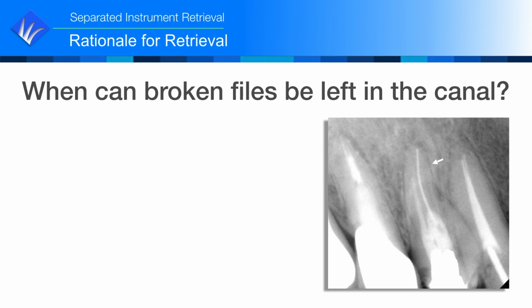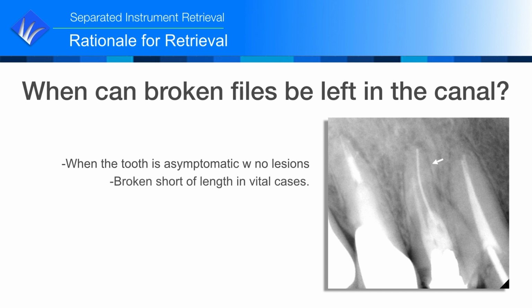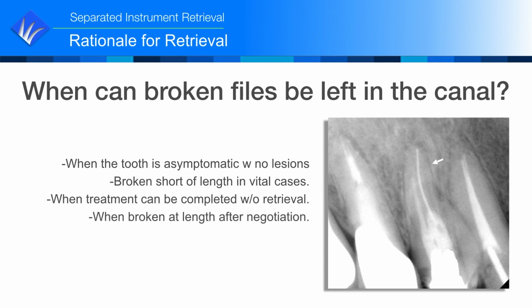4 situations where retrieval is not necessary. 1, when the tooth is asymptomatic with no lesions. 2, when the file is broken short of length in vital cases. 3, when treatment can be completed without retrieval. 4, when broken at length after negotiation.